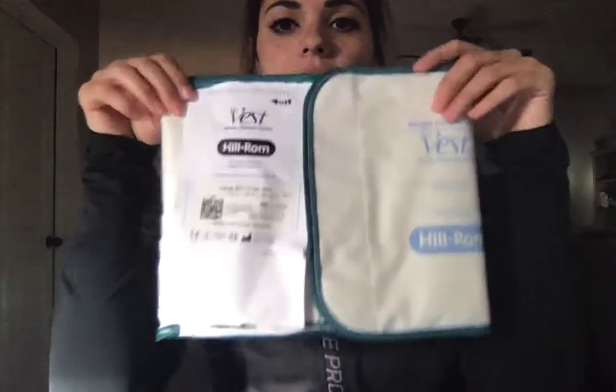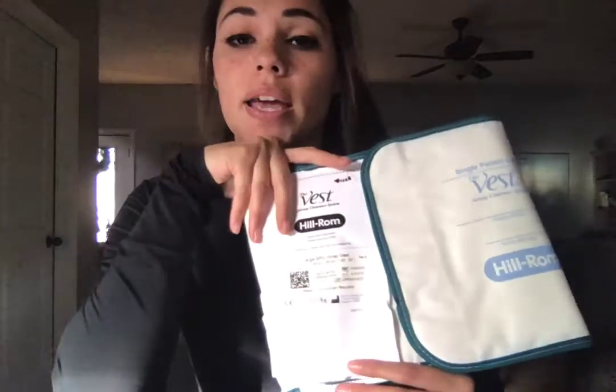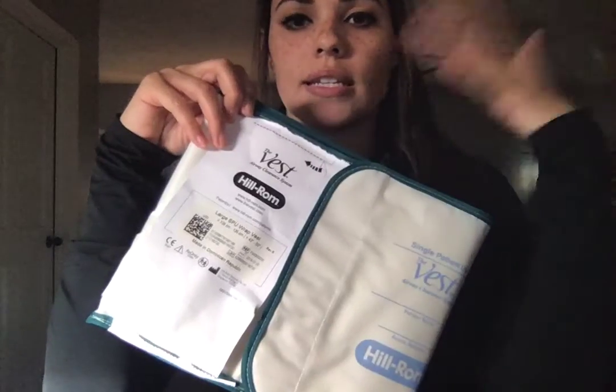I have a vest here that we use for airway clearance. What this is going to do is vibrate and shake up secretions that any patient is having a hard time mobilizing. If a patient comes in with retained secretions and isn't having a productive cough, we can hook this up to them.